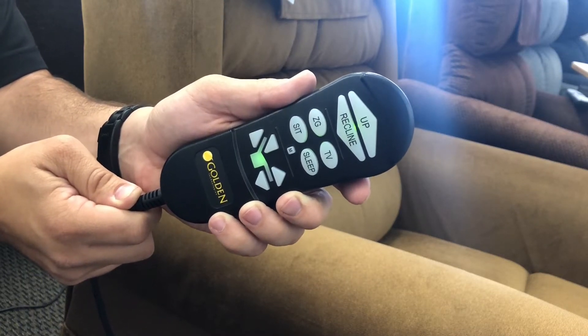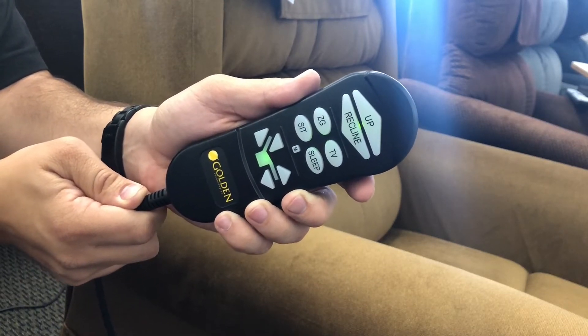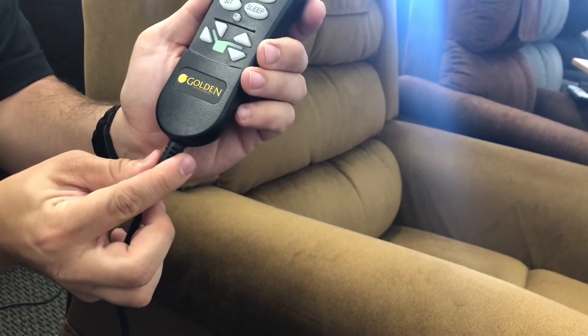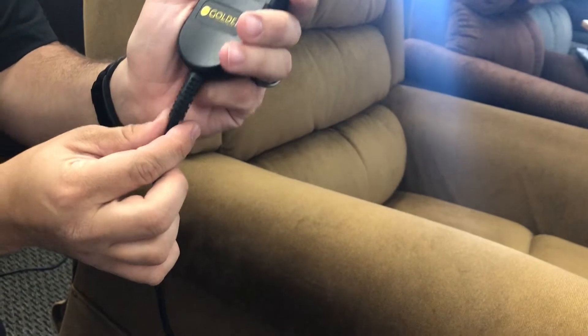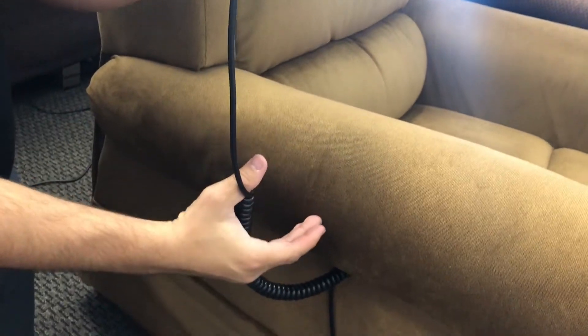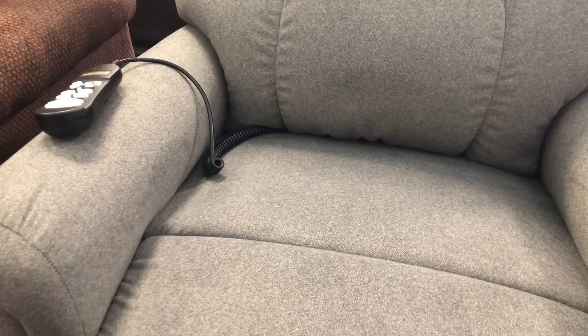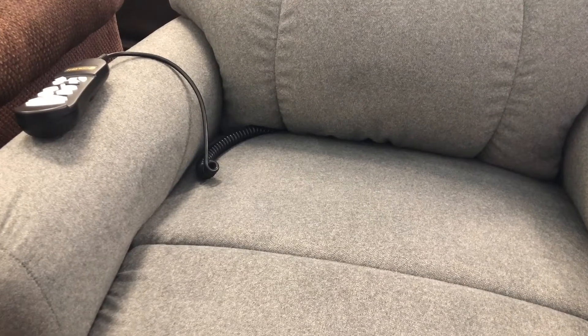Here we will demonstrate how to disconnect your remote on your Golden Technologies PowerLift Recliner. Trace the cord from the back of the remote. This cord will either go over the side of the chair and into the pocket, or it will go between the seat pan and the backrest of the chair.